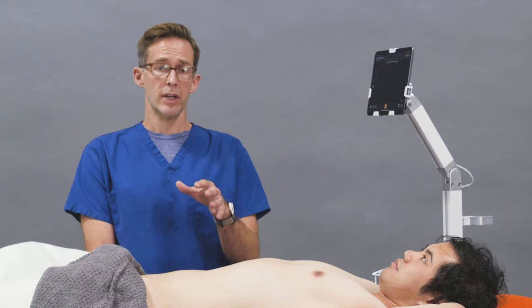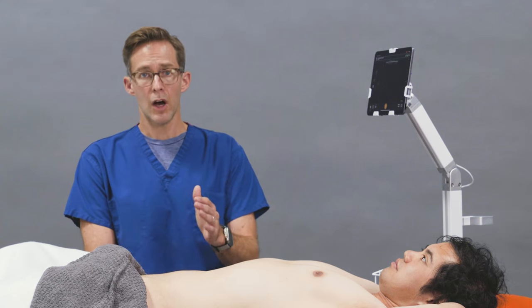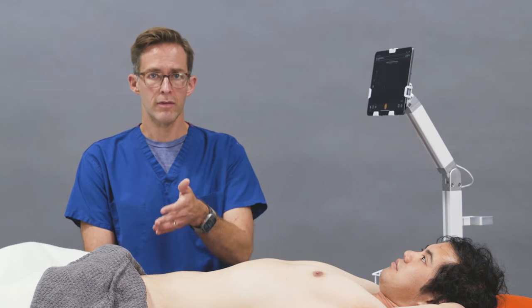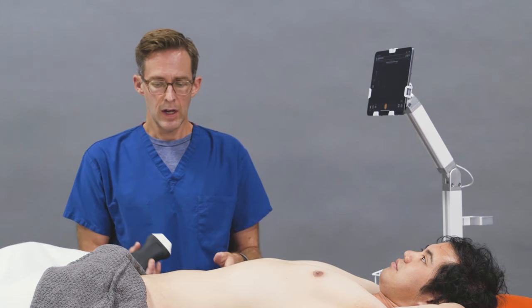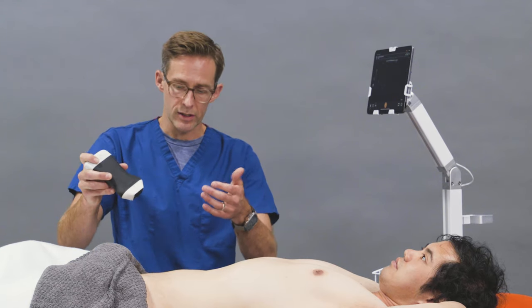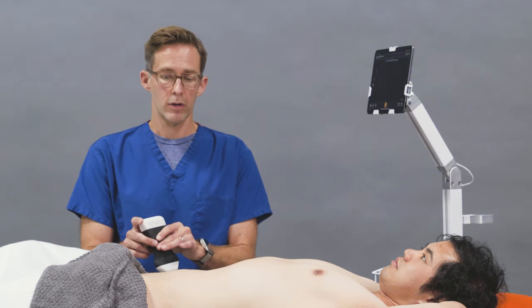We won't be performing a central line today, but we're going to visualize the vital structures. Typically the patient is lying supine, and often you can put them in reverse Trendelenburg. I do a right femoral central line because I'm right-hand dominant. We'll take the ultrasound probe along the inguinal crease, and if the patient can slightly bend out their leg, that gives better access.